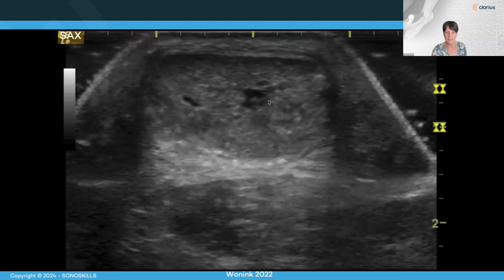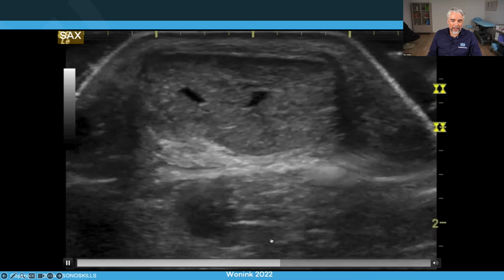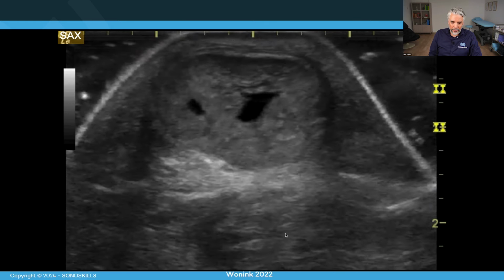So Mark, a normal tendon wouldn't be that squishy, that compressible? No. So the usual tendon is quite hard and not so squishy, and also not so large in cross-sectional area.